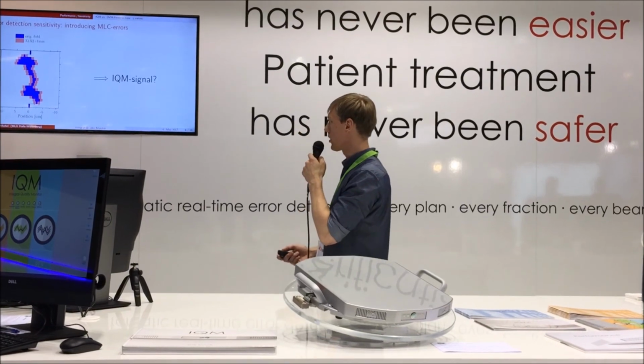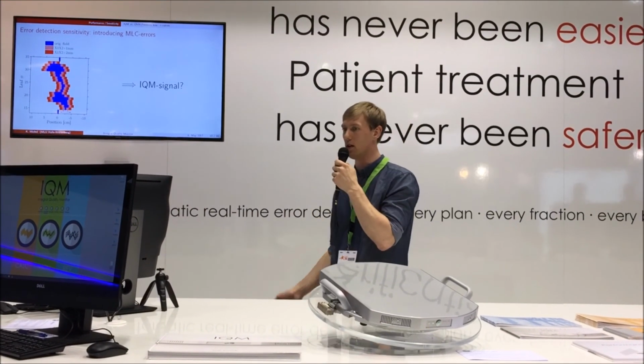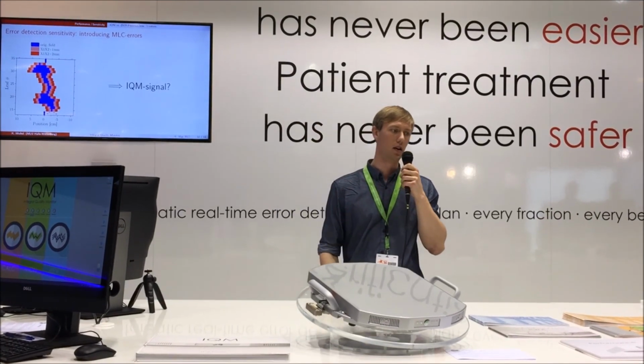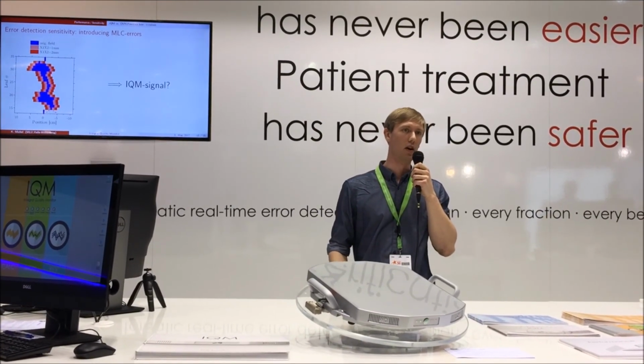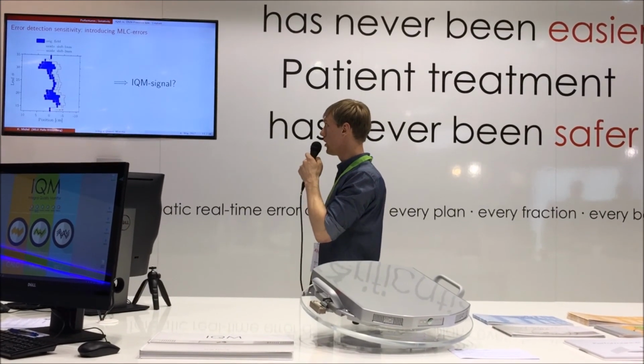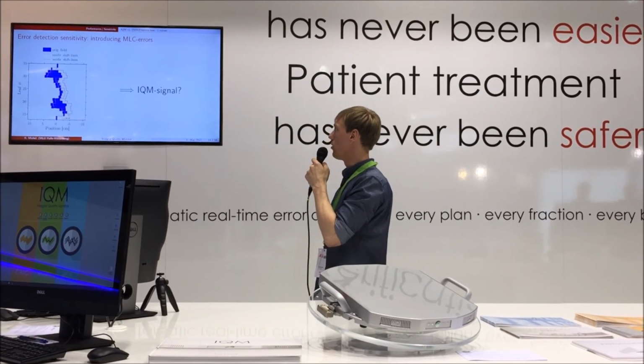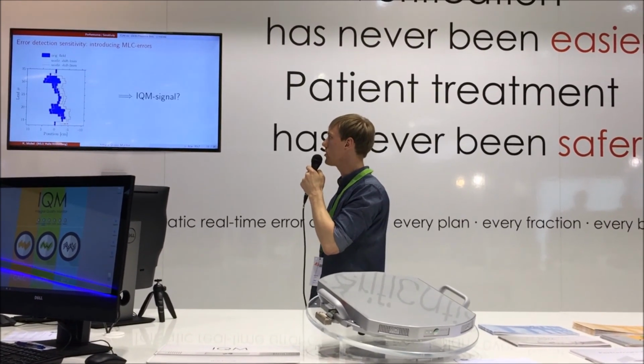So we opened or closed both MLC banks by 1 or 2 millimeters and compared the resulting IQM signal to the one just measured, so the reference of the original plans. Additionally, we introduced unidirectional shifts, also by 1 or 2 millimeters in both directions.